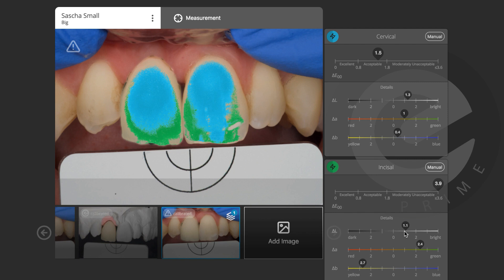Delta B is almost fine. On the incisal edge, delta E is high — delta L is a little lighter, delta A is 2.4, so I'm really missing a lot of red in this area, and delta B is 2.7 so it's quite yellow. Delta E of 3.9 is not acceptable — I need to make corrections here.